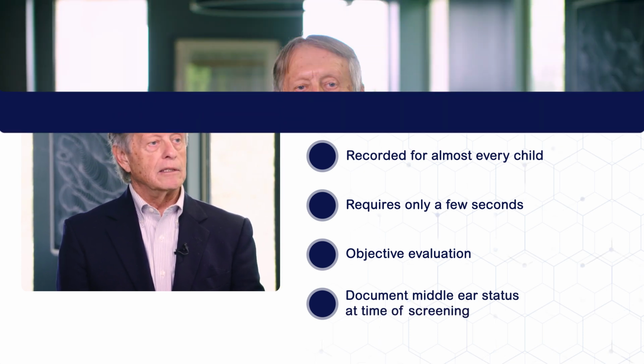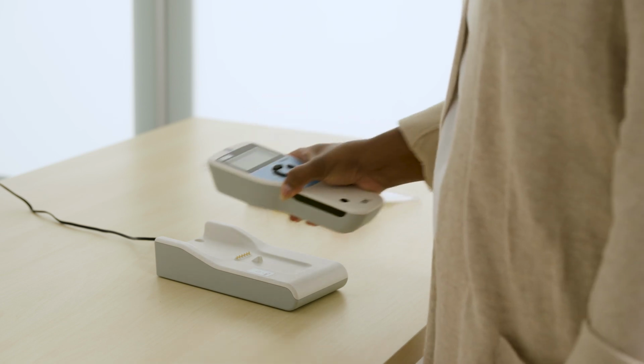Recent research has confirmed that a hearing screening program that uses a combination of tympanometry and DPOAEs will identify kids who need further testing at the same rate as pure tone hearing screening. In addition, the combined DPOAE plus tympanometry screening method will identify some children who would have been missed with the pure tone hearing screening technique. It's also important to note that tympanometry screening can be performed on children who cannot be tested with the pure tone technique.